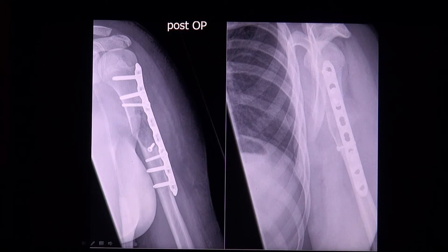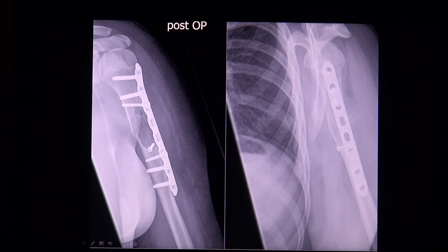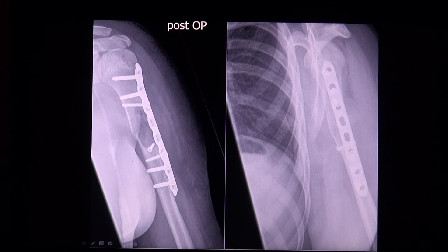Langerhans cell histiocytosis affects the same age group and is hard to differentiate in case of a non-aggressive appearance. A completely lytic enchondroma without cartilaginous matrix also can't be differentiated from a simple bone cyst radiographically. Brown tumours are high on the differential diagnosis list if other signs of hyperparathyroidism are present, like subperiosteal and subchondral bone resorption or decreased bone density.